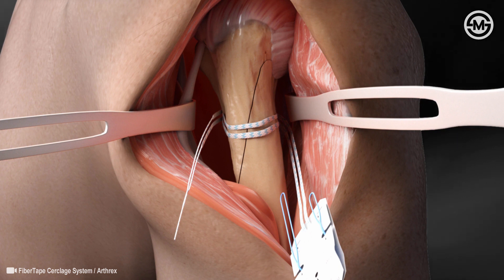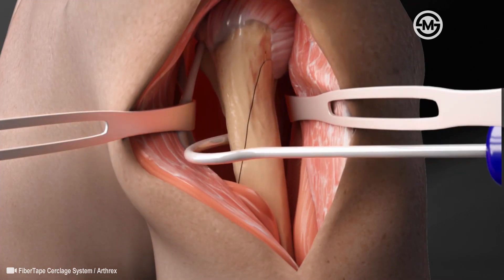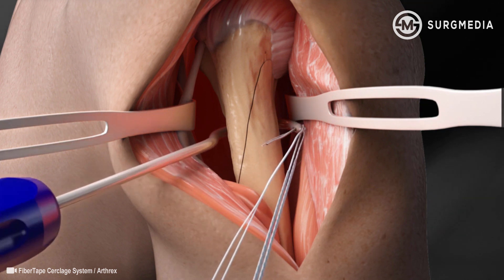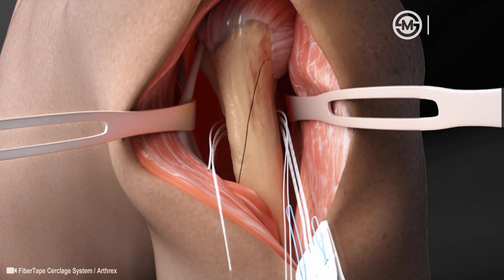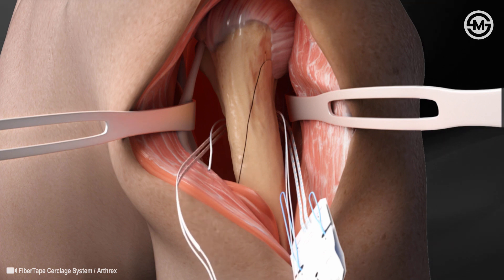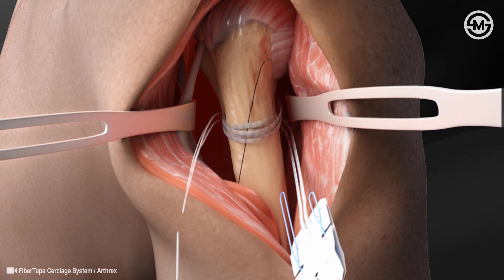If preferred, there is a passing hook that could also be used to facilitate the passing of the circlage suture. The hook is placed around the bone. Then the Fiber Tape Circlage suture tail is loaded into the eyelet of the hook along with a Fiber Link Suture. The hook is pulled back around the bone and the sutures are unloaded from the eyelet. Next, the tail of the Fiber Tape Suture is loaded into the Fiber Link Loop to complete the second pass around the bone.